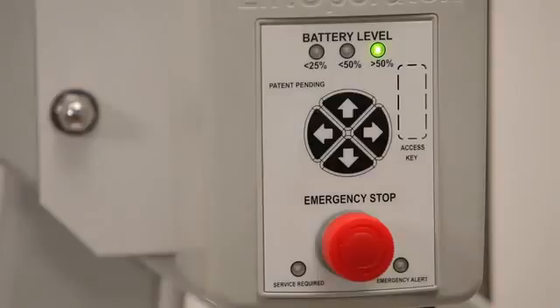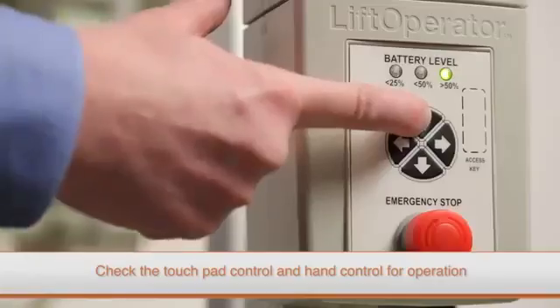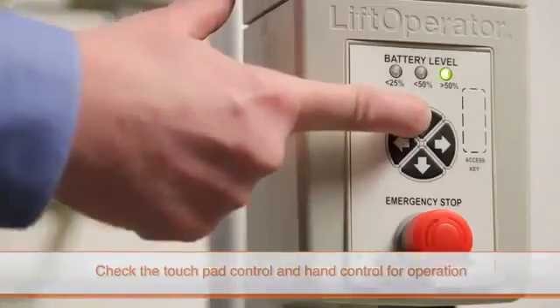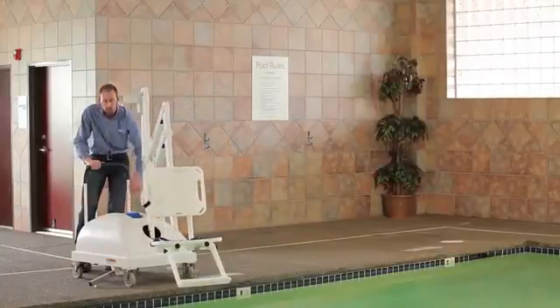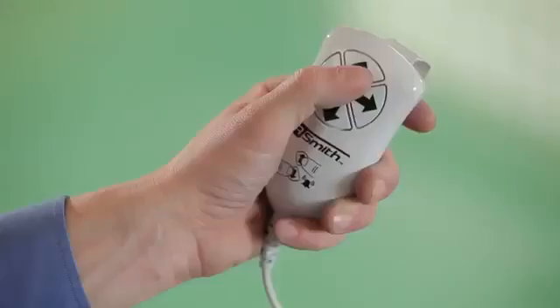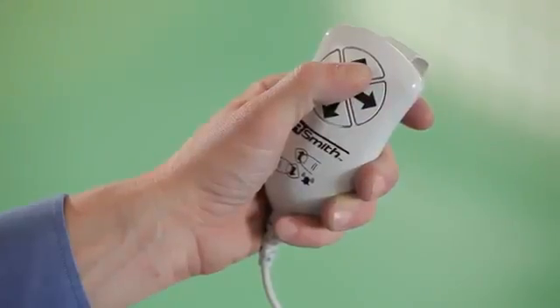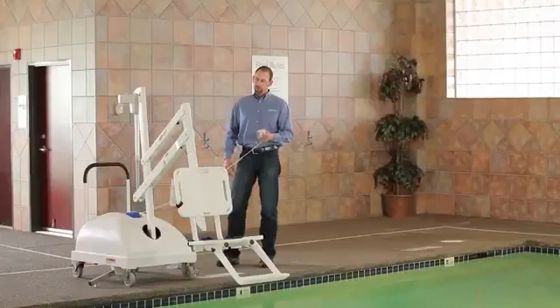If the battery pack is fully charged and the lift still does not operate, the lift controls need to be checked. First, test the functions of the touchpad by pressing the up and down and left and right control buttons. If the lift operates correctly, test the functions of the hand control. Press the up and down and left and right control buttons on the hand control. If the lift does not operate correctly, the hand control may need to be replaced.